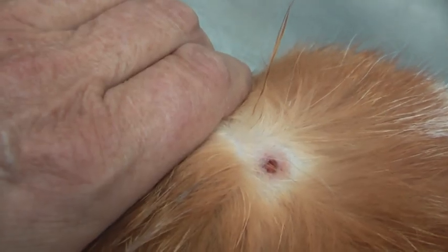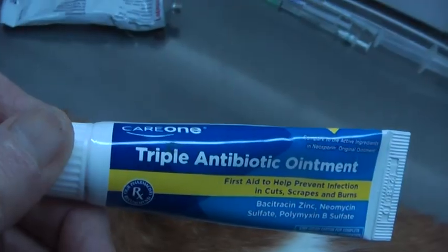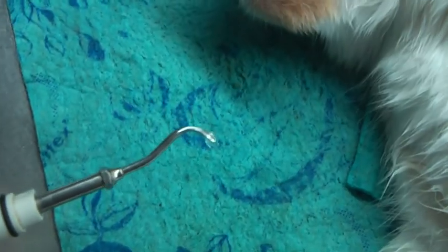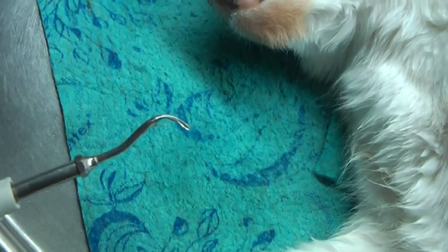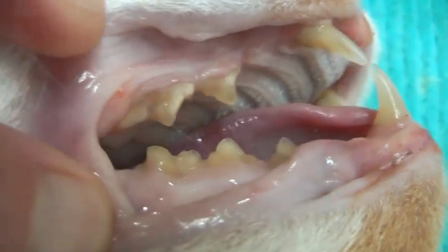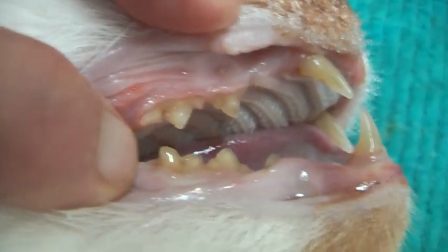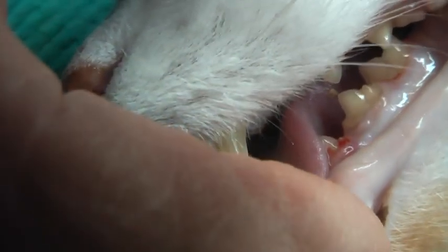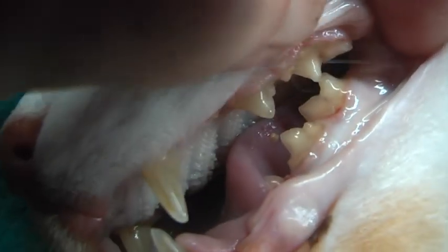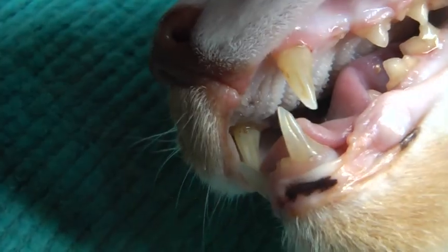I removed it — just a small thing, not for chewing. I should clean the teeth here. Some work to do here too. This one down there — okay, it's a bit damaged, but it doesn't matter; this is an old cat. I considered pulling it out, but I won't. He's 15 to 16 years old.